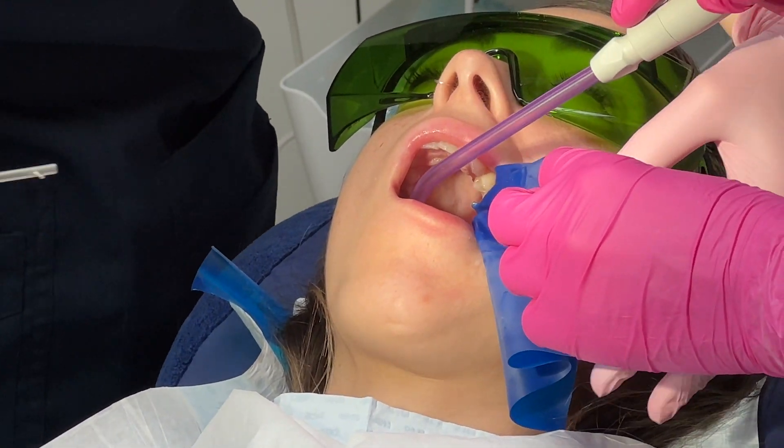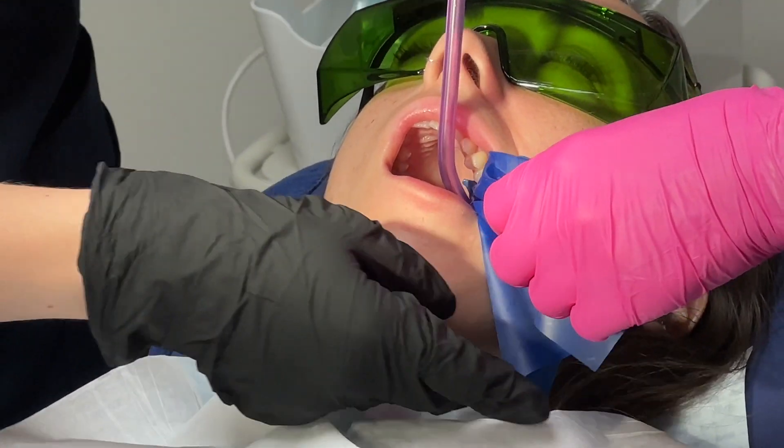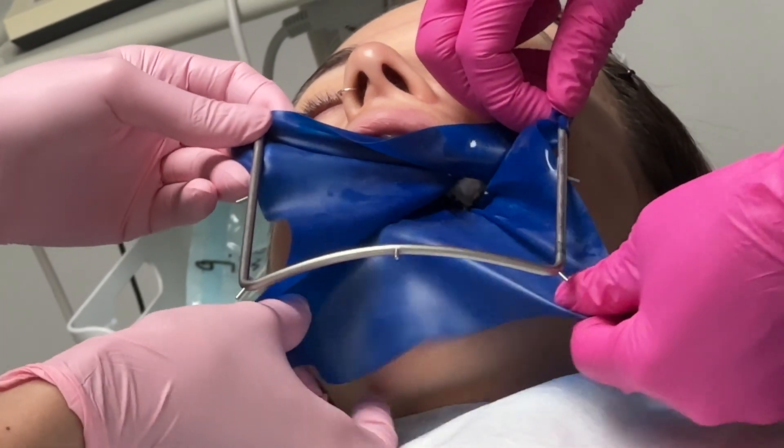So if you need to use a dental dam, please use it, because not using it can lead to a poor result in dental techniques.